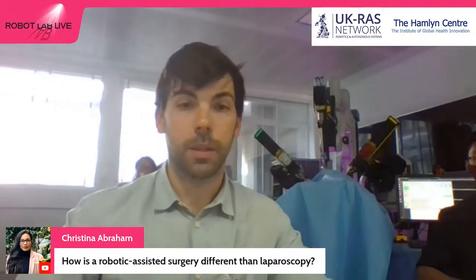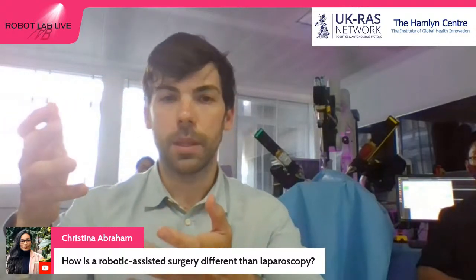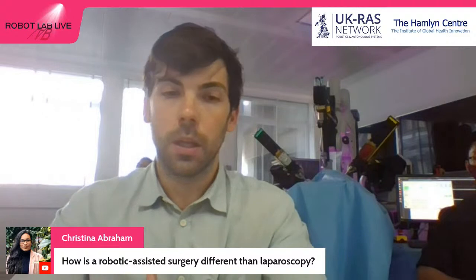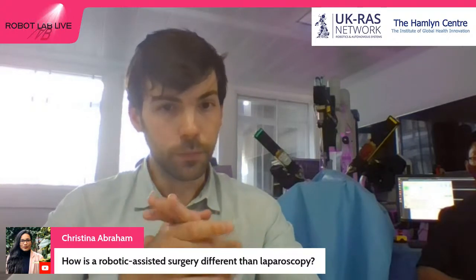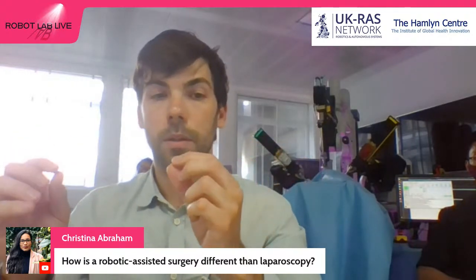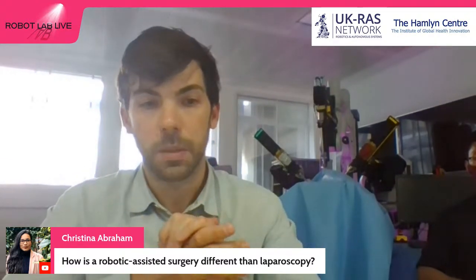And one that we haven't mentioned, but for me is one of the coolest, is tremor. If you think of a surgeon moving a laparoscopic tool, we all have some inherent tremor in our hand, right? So the tool will be trembling a bit, even if you're a super amazing experienced surgeon. But with robotic-assisted surgery, we can use different control approaches to remove this tremor. So even though the hands of the surgeon may tremble a bit, that will not be seen in the tool, which will run smoothly without the tremor. That would be one of the differences between both of them.